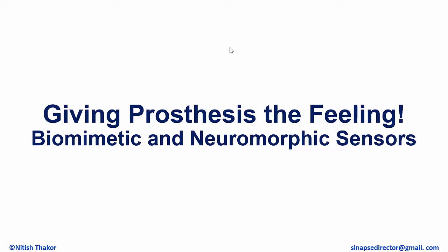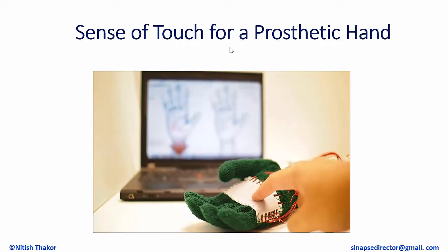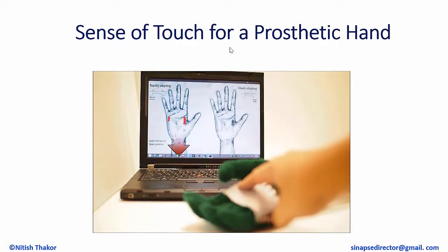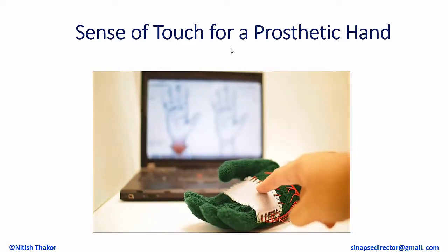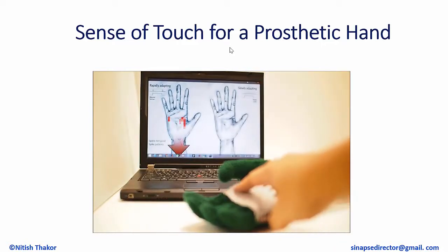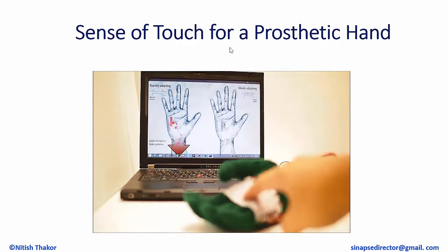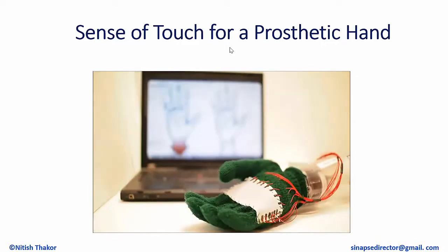So I want to say, well, how do I get that feeling back? How does that amputee get the sensory feeling? So the e-skin here is on the hand, or a glove on a prosthetic hand. You see in the graphic on the left side the fast receptors at work, and on the right side the slow receptors. The fast ones are looking at the change, and the slow ones are looking at the applied continuous pressure. By the way, you see small red dots going out, and those are the nerve signals. So we can now take the sensor input and relay that as nerve information.